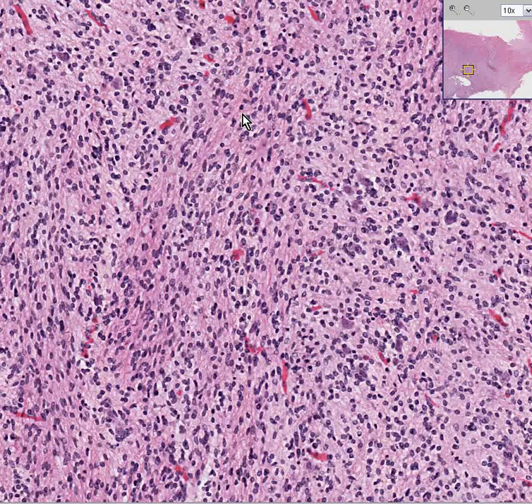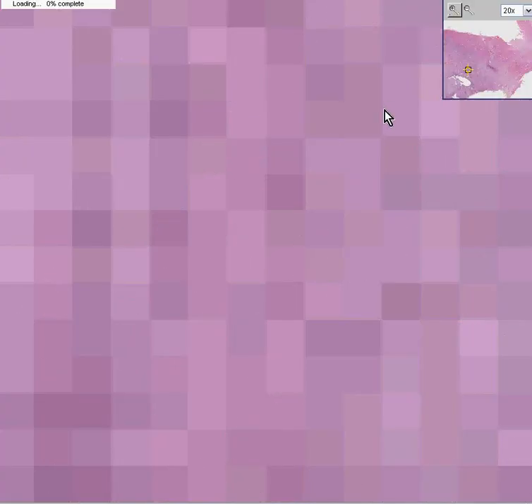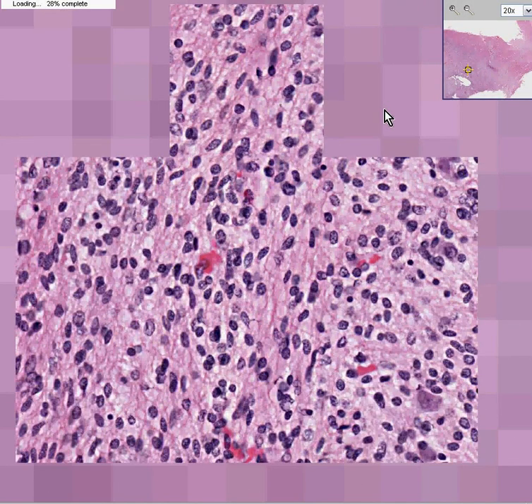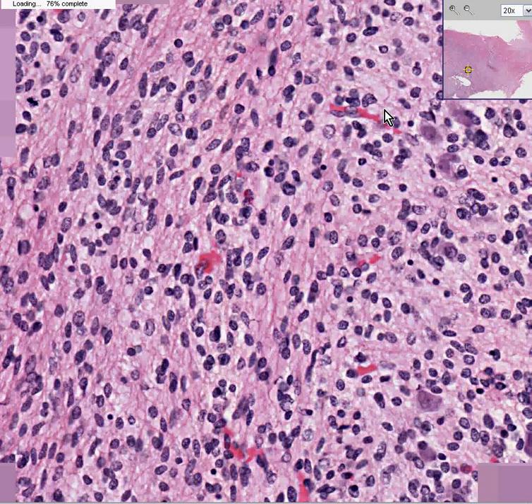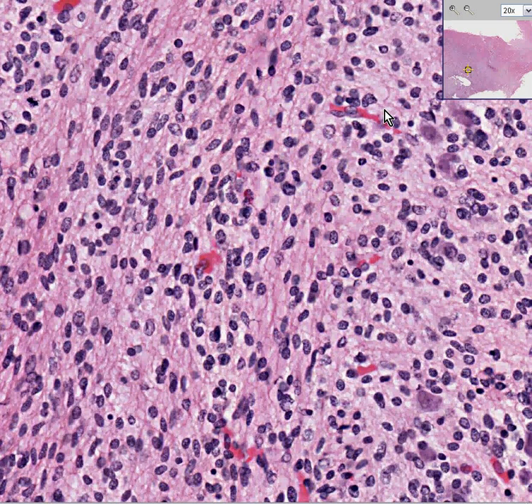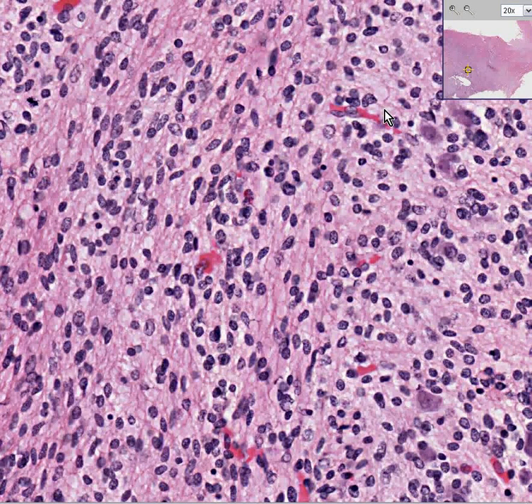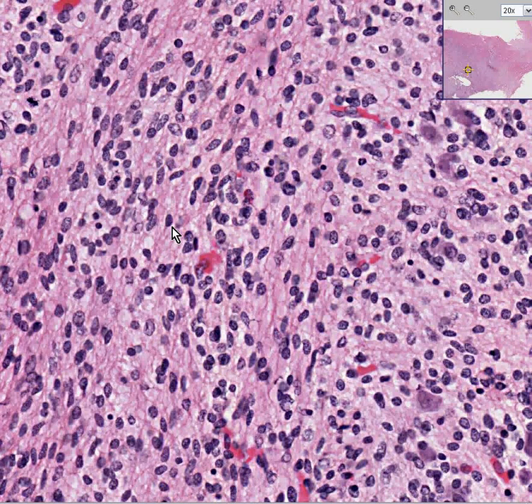And this is very typical for many of the low-grade gliomas. Often, it is agonizingly difficult to differentiate a low-grade glioma from gliosis, not only radiologically and grossly, but microscopically as well. There are a set of criteria that help differentiate gliosis from low-grade gliomas, but sometimes it really comes down to the wire. Nevertheless, in this case, we could pretty safely say this is not gliosis — this is a glioma. Because in the tumor areas like this, they all look like tumor cells, although they are not highly, bizarrely pleomorphic and necrotic like we see with the high-grade gliomas, i.e. glioblastoma multiforme. Thank you very much.